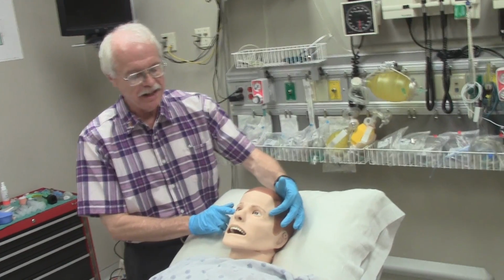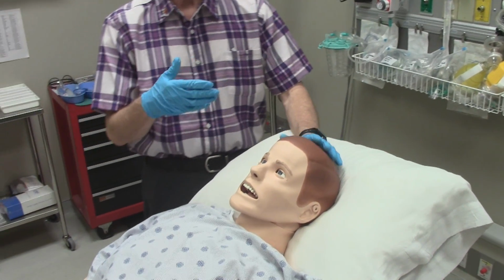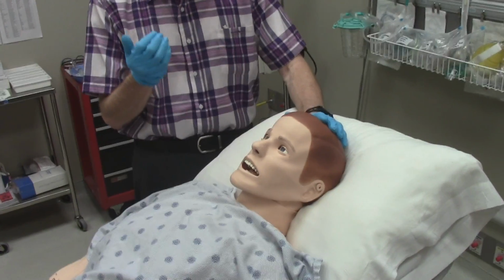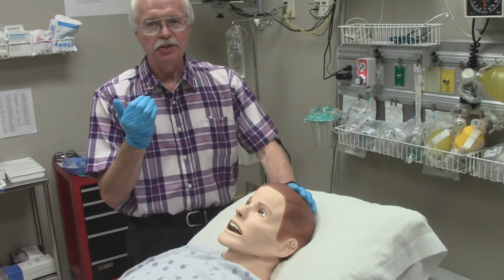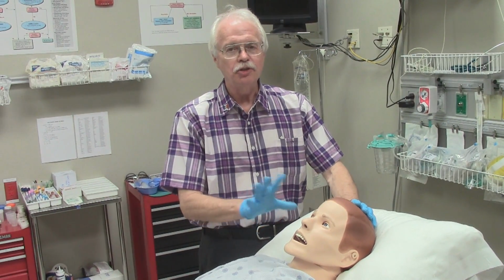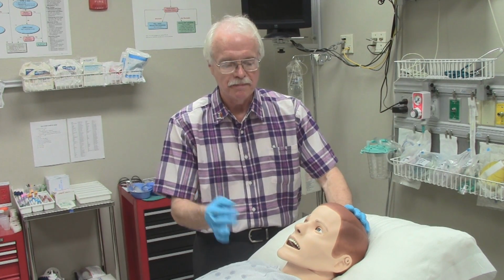You'll notice that the patient does blink. Blink for us, please. There we go. And the blink speed can be varied by the instructor. Also, the instructor can give the patient a kind of a sleepy, half-open look to their eyes. They can make one eye blink and the other one not blink to simulate a motor deficit, like the one that, for example, might be caused by a cerebrovascular accident.